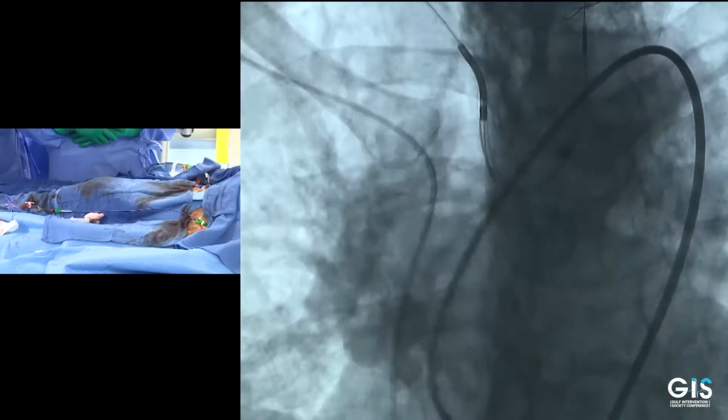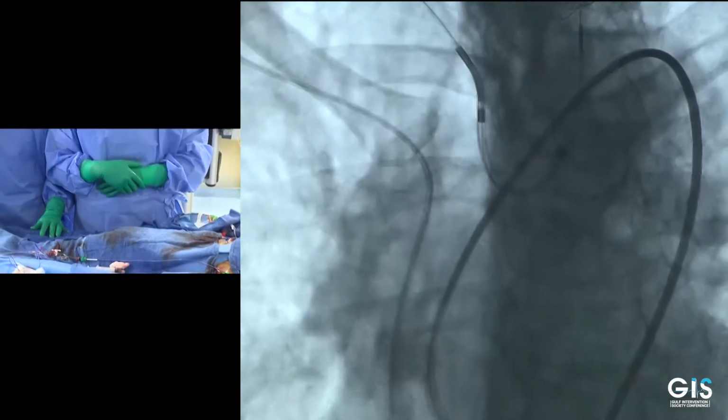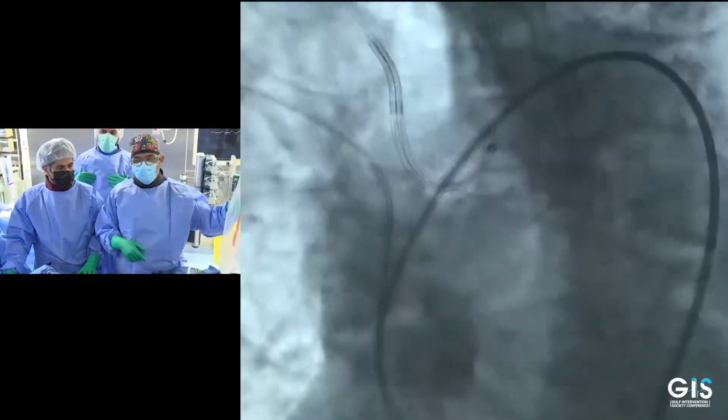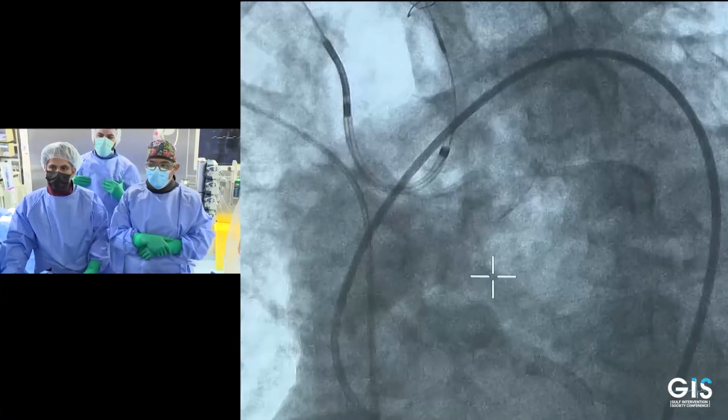So what we're going to be doing now is obtaining our angiogram for both angles, 3 cusp views, and also overlap views. So we're going to take those angles. We have already determined that by our pre-processing of the CT result, and we'll go ahead with that. Okay, first angle.